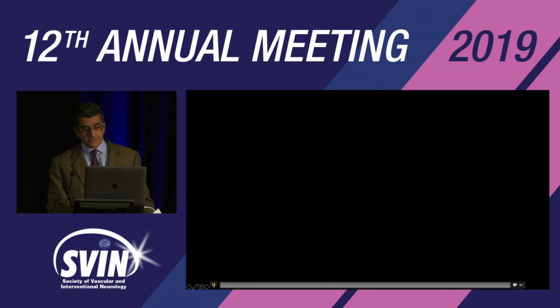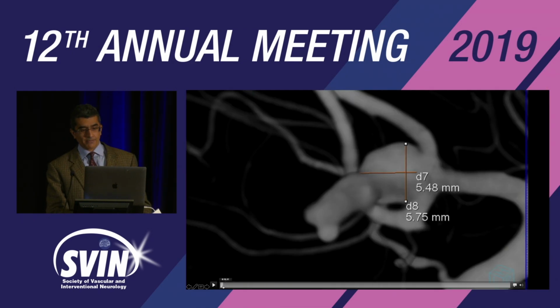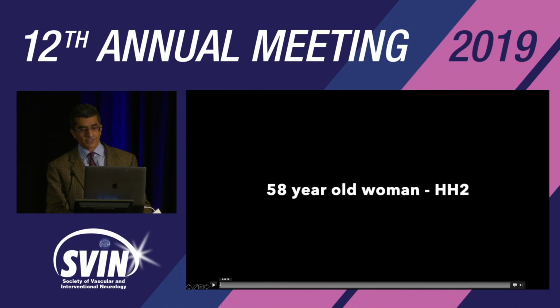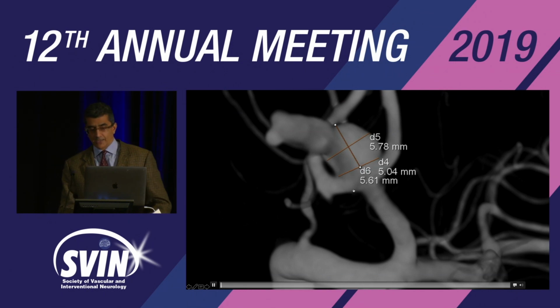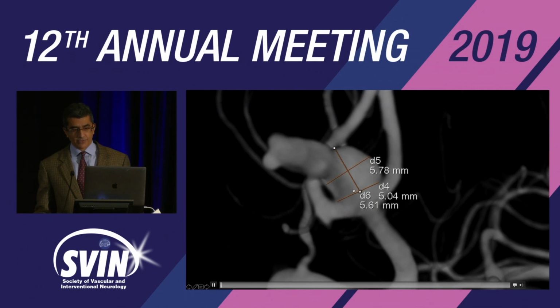So this is a case of a ruptured anterior communicating artery aneurysm, Hunt-Hess grade 2 in a 58-year-old woman. You can see the large pseudoaneurysm component. And again, I won't go into the measurements because this has already been discussed.